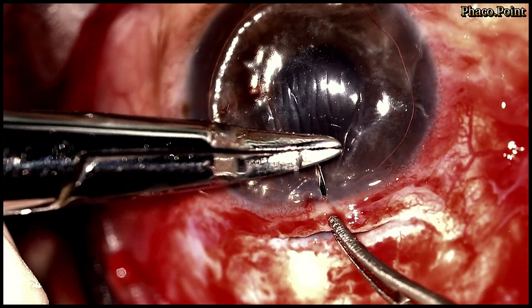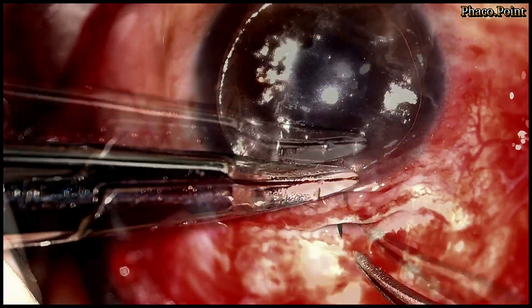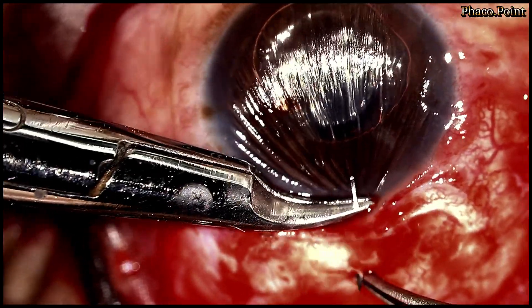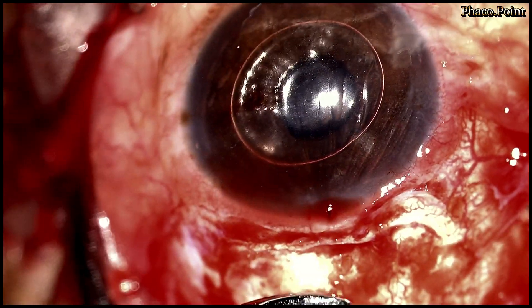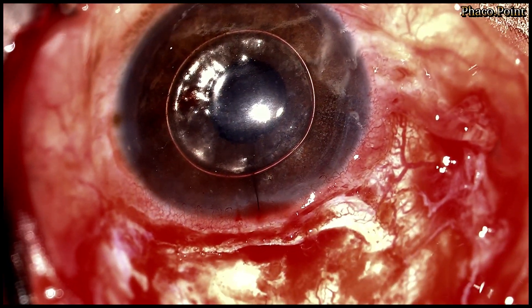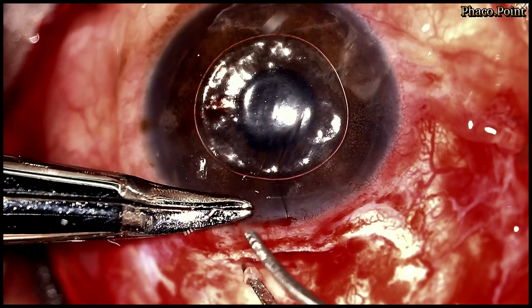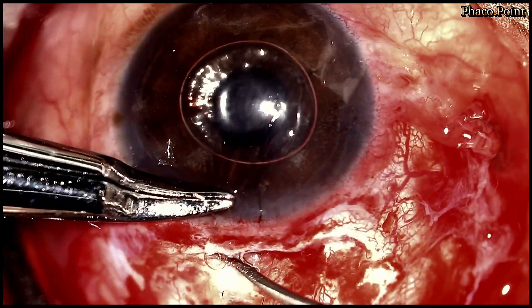Now having achieved a well-formed anterior chamber, this main SICS tunnel is closed down with the help of three interrupted 10-O-nylon buried sutures. This is what you will see in this part of the video.